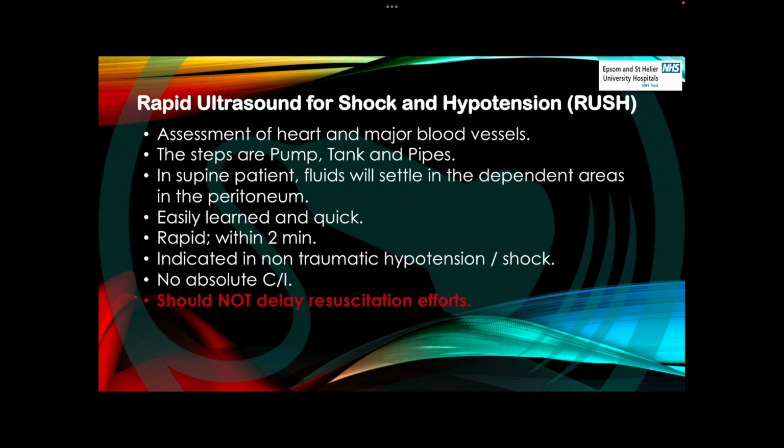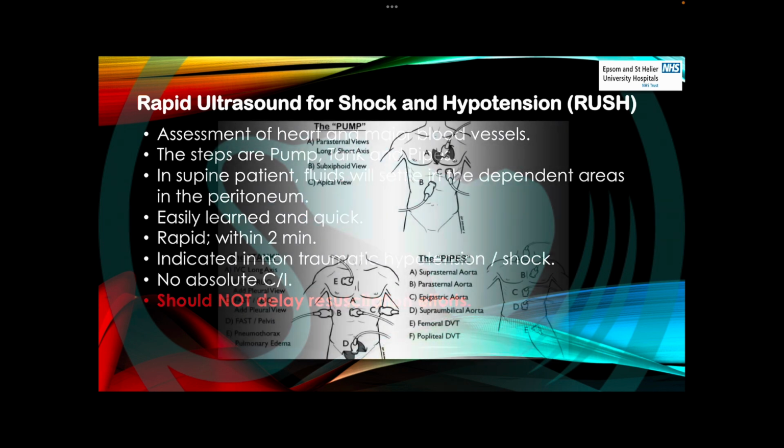The most important thing is that you should not delay the resuscitation effort. So it's not like taking a huge or long time in order to do these protocols or to examine the patient with the ultrasound. So just get the idea and then start to manage the patient.